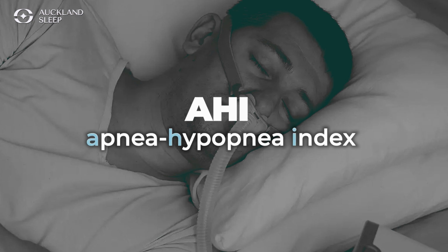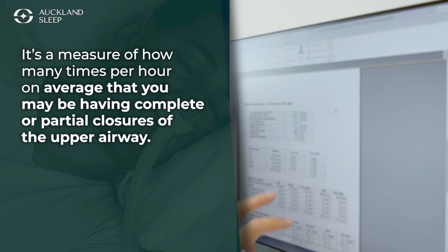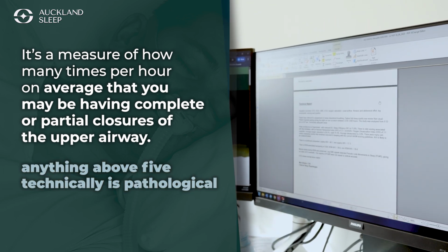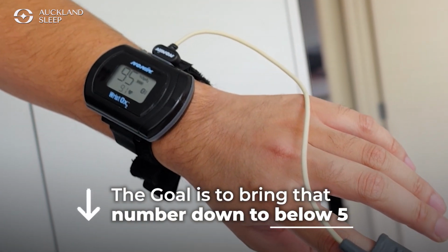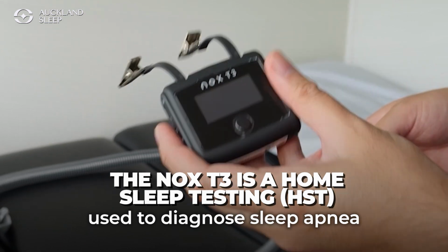The most important variable we're looking at is called the AHI, the apnea-hypopnea index. It's a measure of how many times per hour on average that you may be having complete or partial closures of the upper airway. Anything above 5 technically is pathological. It's classified as varying severities of sleep apnea. So what we're trying to do is bring that AHI number down to below 5. That's what's considered the normal limit. It should reduce breaking sleep, taking sleep from a deeper stage into a lighter stage of sleep, or perhaps even into wakefulness.